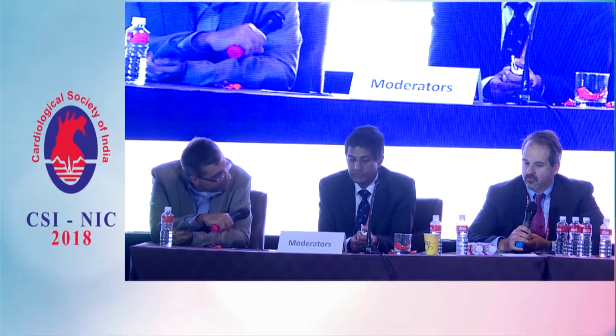And if there's still active bleeding, then we make a decision based on how young the patient is, how active he is, and what potential morbidity might be introduced by putting a covered stent across the femoral head versus a surgical cut down and a quick repair. We basically use the same approach. The only thing is, if we think they're high risk for vascular complications, we actually consent the patient for a stent.